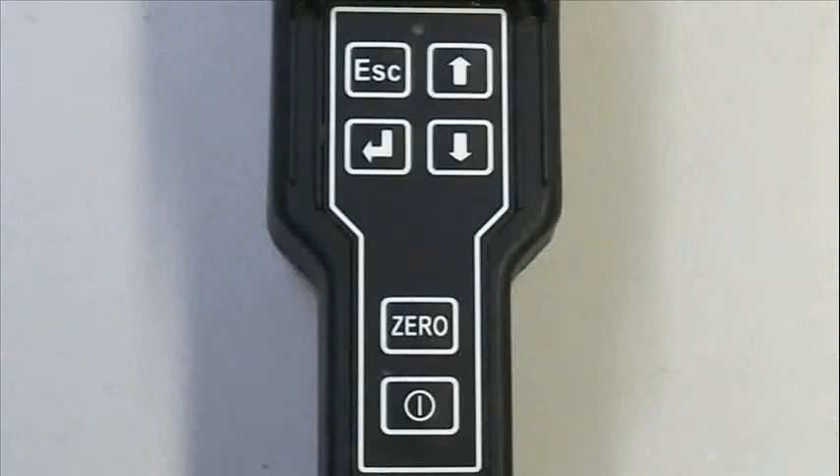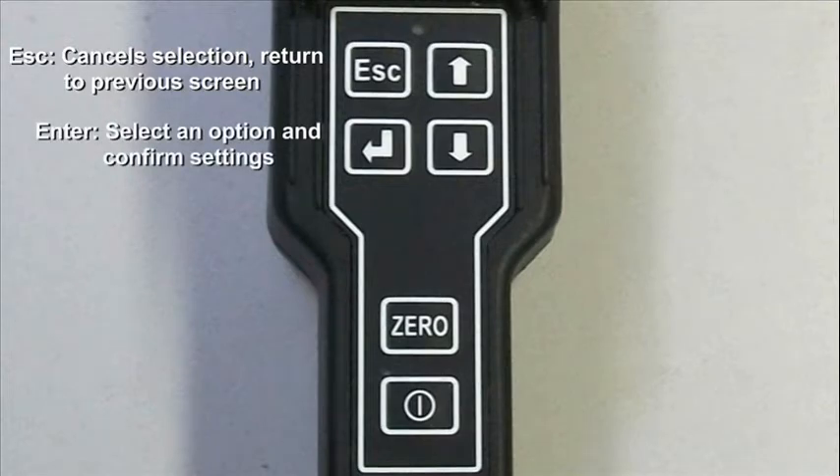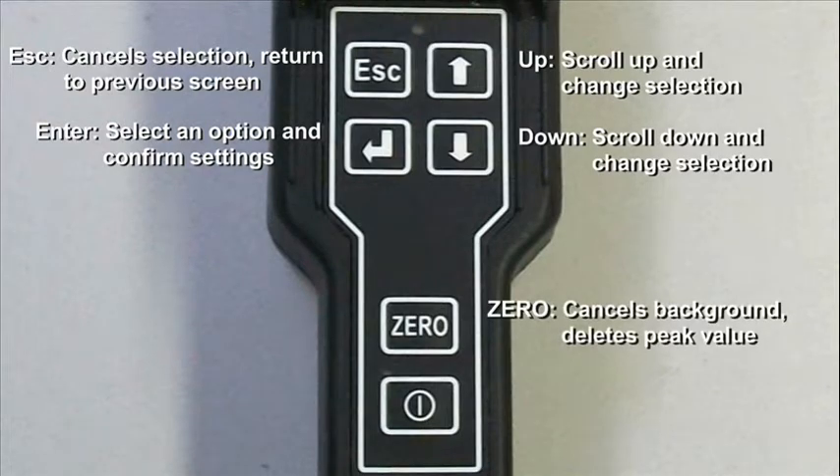Before we begin, here is a brief explanation of the unit's keypad. The escape button will cancel your selection or return to the previous screen. The enter button will select an option or confirm settings. Use the arrow buttons to scroll through and change your selection. The zero button is used to cancel out background readings and clear the previous peak value.